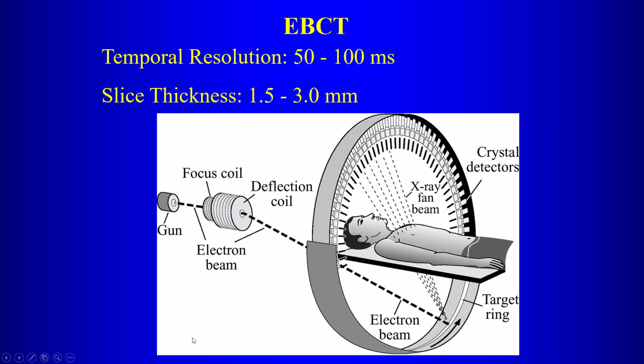And so the X-ray beam itself could be rapidly rotated around the patient. So the early days of cardiac imaging were done with electron beam CT. Now that we have multi-detector CT, this is no longer necessary, as the multi-detector CT scanners are fast enough to do diagnostic coronary artery imaging. Although temporal resolution was always better with electron beam CT than with the conventional CT.